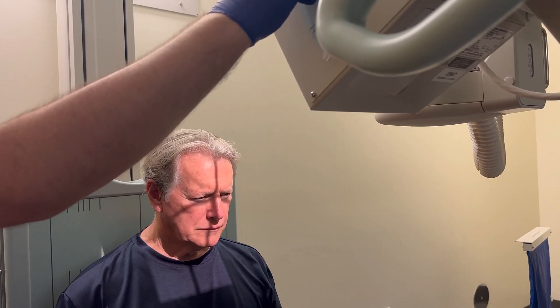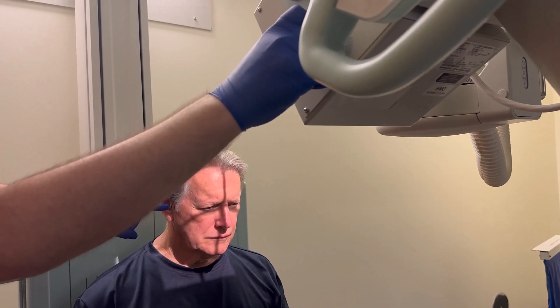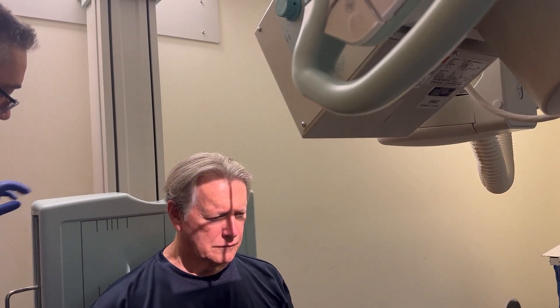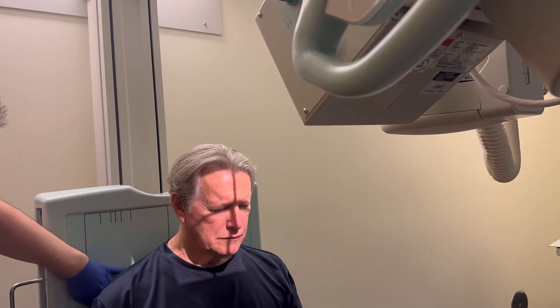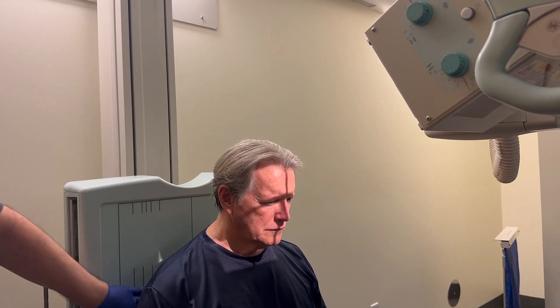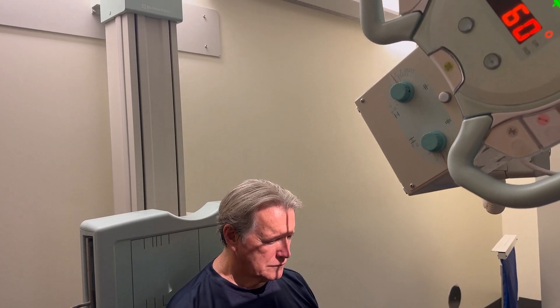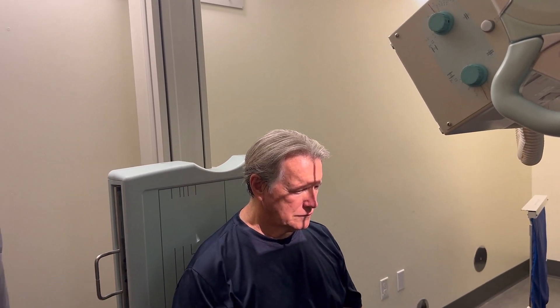Make sure you don't collimate off the mandible itself. You need from the condyles down to the mentum. I'm just going to move my marker in a little bit — I'm putting it in the lower angle of the light field because the mandible comes to a V and I have room off to the side. So I have a right marker down here, and it looks really low like it's centered over his T-spine, and that's just because of the 30-degree caudal angle. I think that looks pretty good. We're going to take this on suspended respiration.